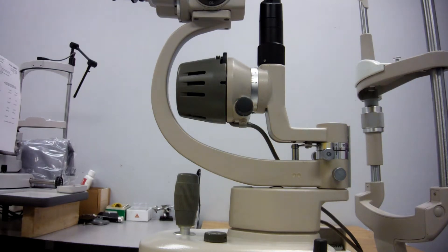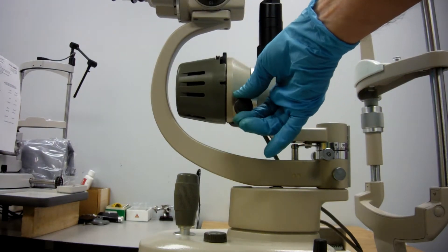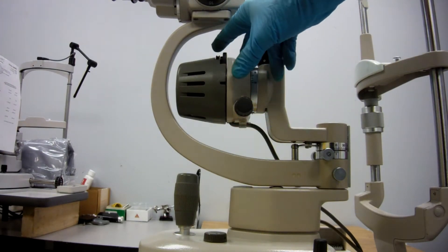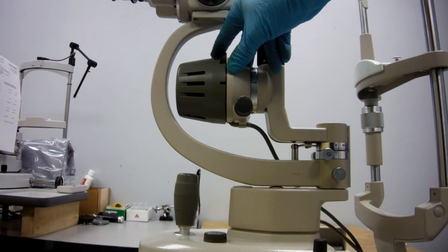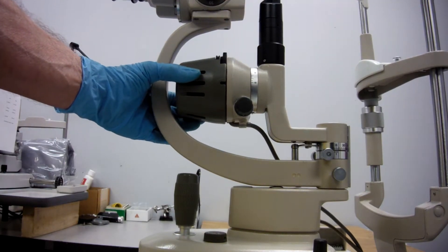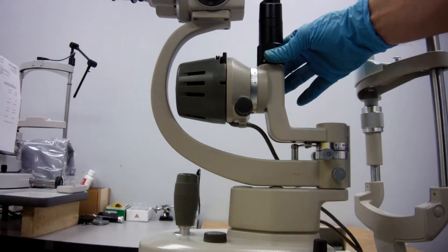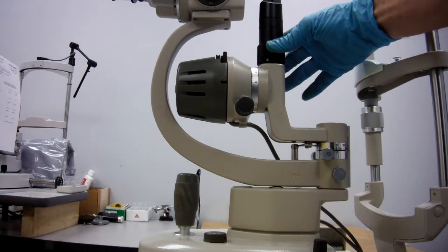This is the G2 Ultra. Some of the common issues are stiff slit control mechanism, stiff diaphragm and filter wheels, a loose body, and a stiff prism rotation.